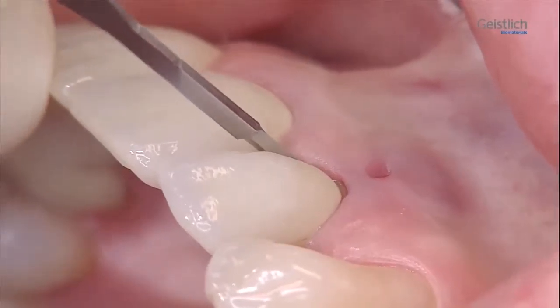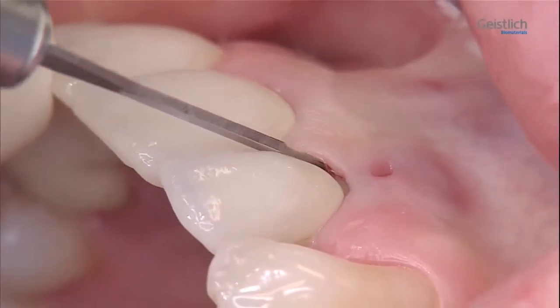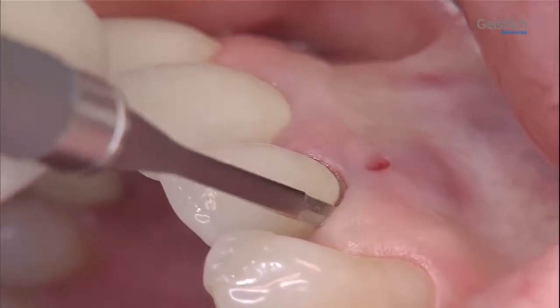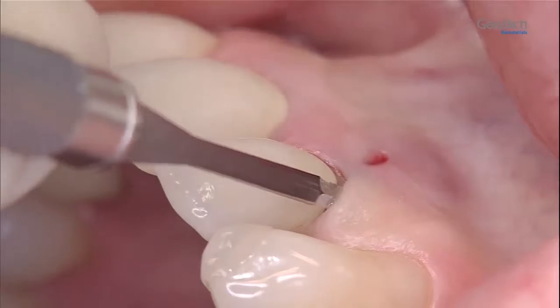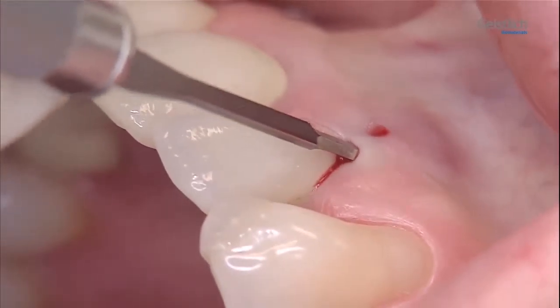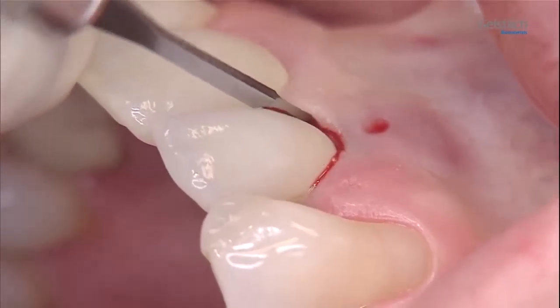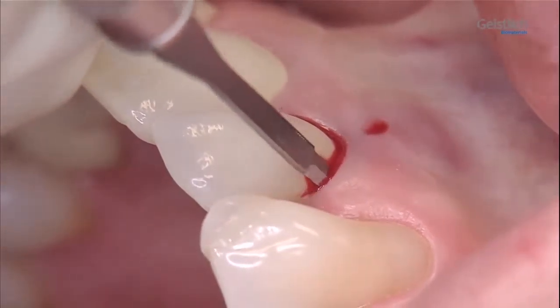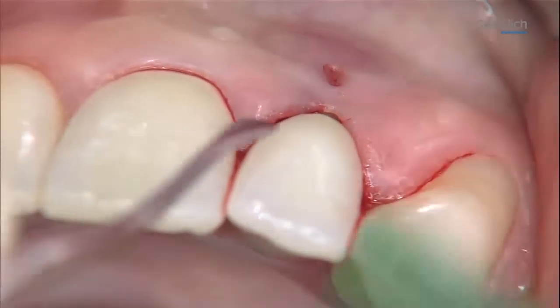First, we remove the remaining granulation and connective tissue from the buccal tooth surface with a micro scalpel blade. Additionally, any accessible Sharpey's fibers in the region are severed. For this, we use a periotome and a tunneling instrument according to ZUR.